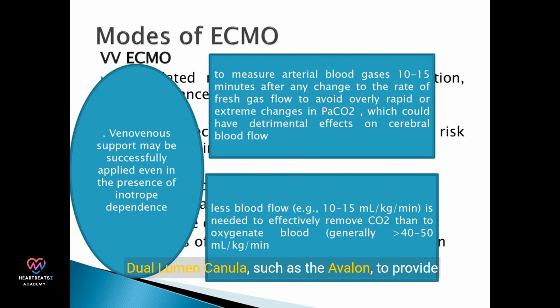Surgical cannulation is a critical step in VA ECMO. It involves inserting cannulas into the patient's blood vessels to facilitate the ECMO process. Potential complications of VA ECMO include bleeding, infection, and thrombosis. It is essential to monitor patients closely to manage these risks.